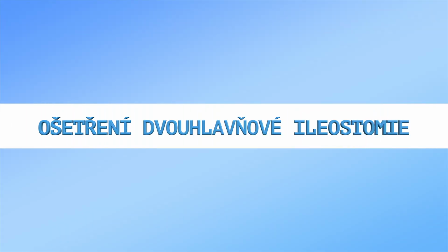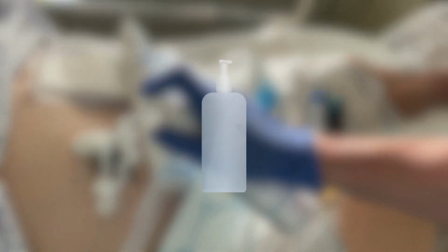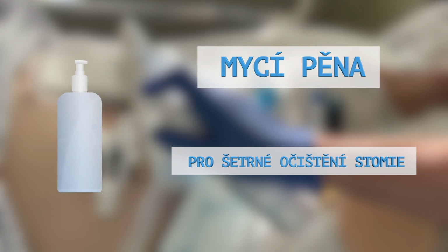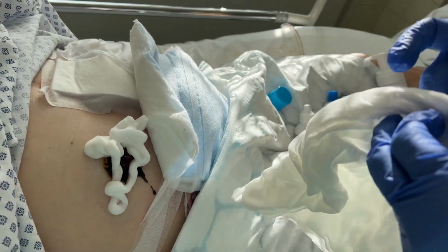Double barrel stoma. If anatomical conditions allow, it is constructed so that the afferent loop carrying stool is sutured higher above the abdominal wall to avoid complications in stoma care. For appliance removal, we use adhesive removers and clean the area around the stoma with stoma care foam. Special care is taken when wiping near the intestinal mucosa to prevent bleeding. The care and use of accessories for this type of stoma are the same.